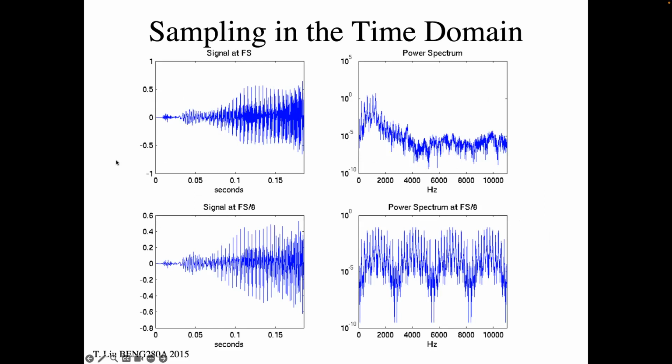So in MR, the way the signal is sampled is in the time domain. We excite a radio frequency signal from the patient. The patient is producing radio frequency energy from all parts of their body that have protons. And then you put an RF coil up to it that's tuned to, say, 64 megahertz if it's 1.5 T, or 128 megahertz if it's 3 T. You put that coil up and you listen, right?